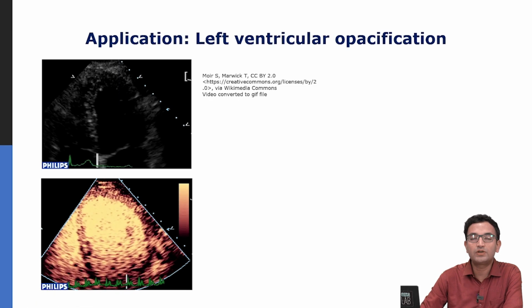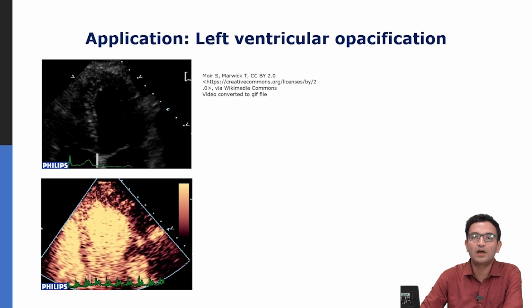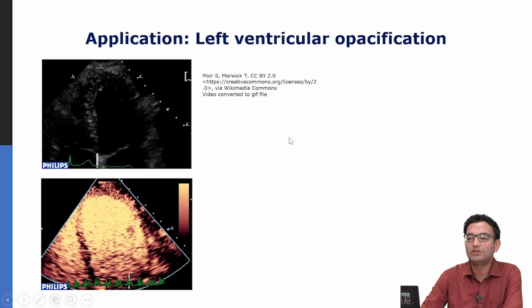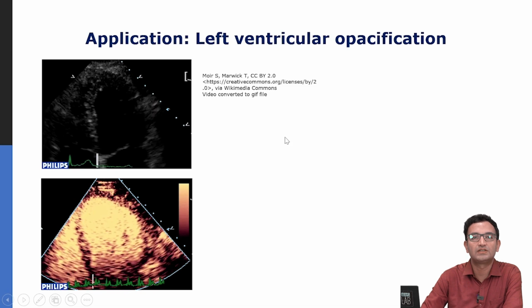Now this can be used to calculate the ejection fraction and get a proper estimate. So this is one of the oldest applications which were approved for ultrasound contrast agents.